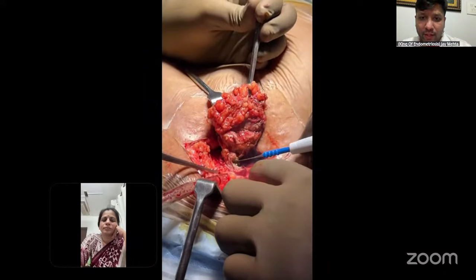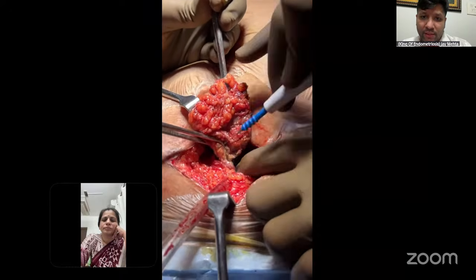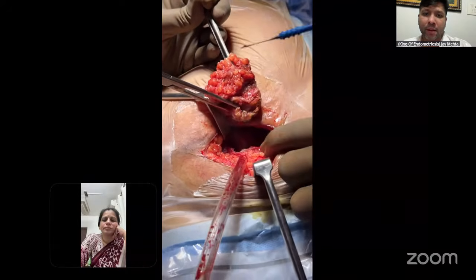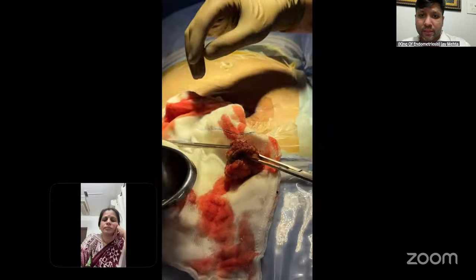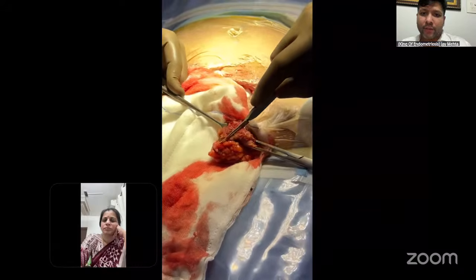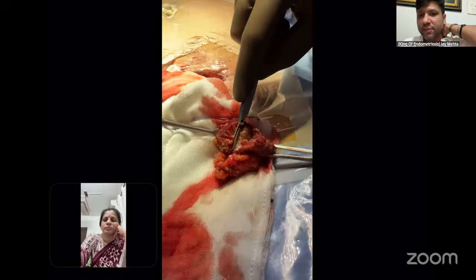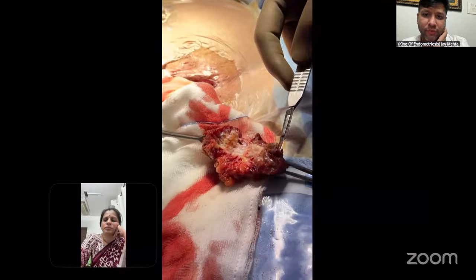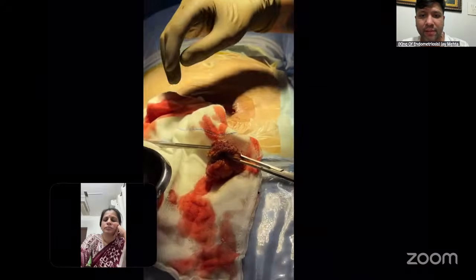The same thing, you are cutting the nodule, leaving the free fat behind. Okay. I'm cutting through the muscle there. I'm using simple monopolar. People can use sharer. People can use harmonic. You can see that the whole nodule has gone. Okay. This is that entire nodule. If I cut open the nodule and show it to you, it will correlate exactly. You can see the fat around it. That entire fat comes out as margin, and you can see this entire large nodule, which we have removed completely with free margins. So you can see the nodule and those free margins there.